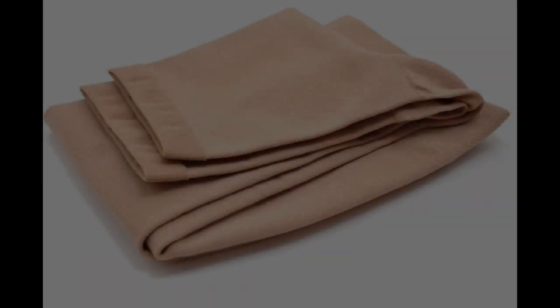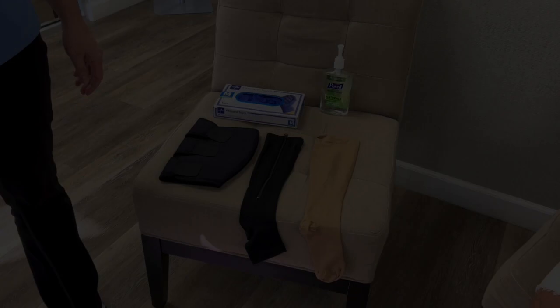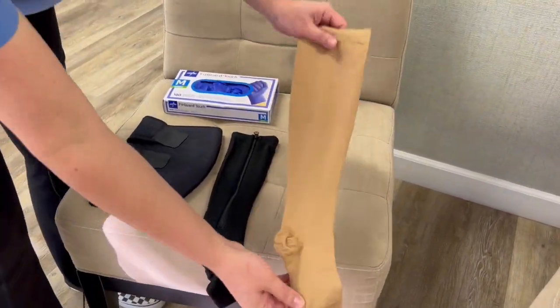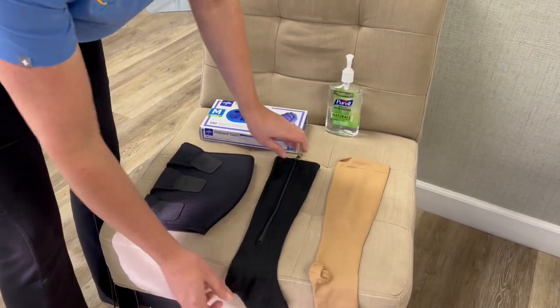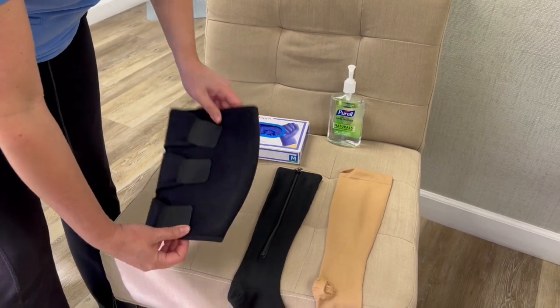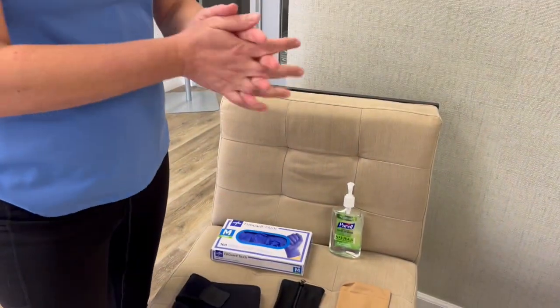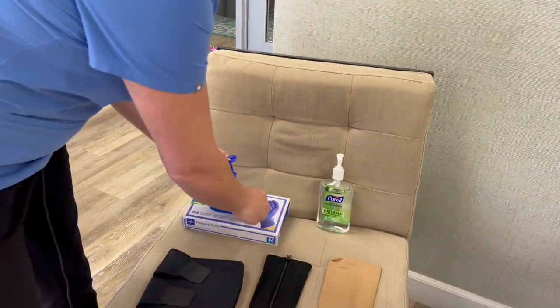They can, however, be very difficult to get on and off, especially for the elderly or overweight. Today we're going to show you three kinds of compression stockings: the traditional stretchy, one with a zipper which is a little easier, and a Velcro option. We're going to start with some hand hygiene and put on our gloves.